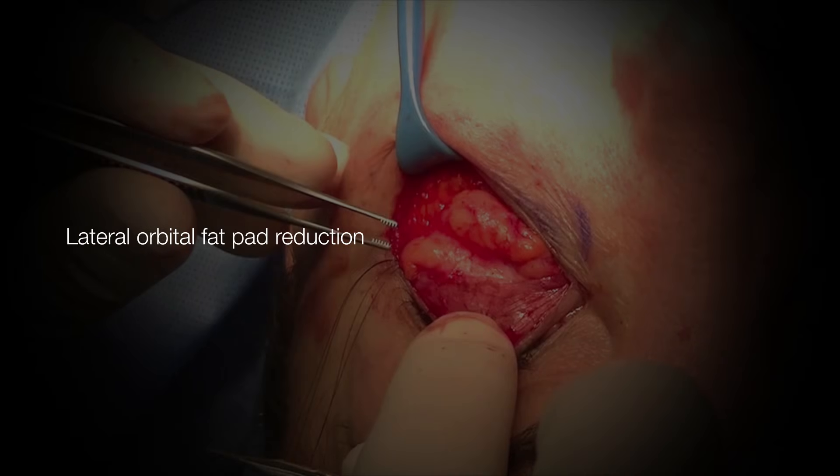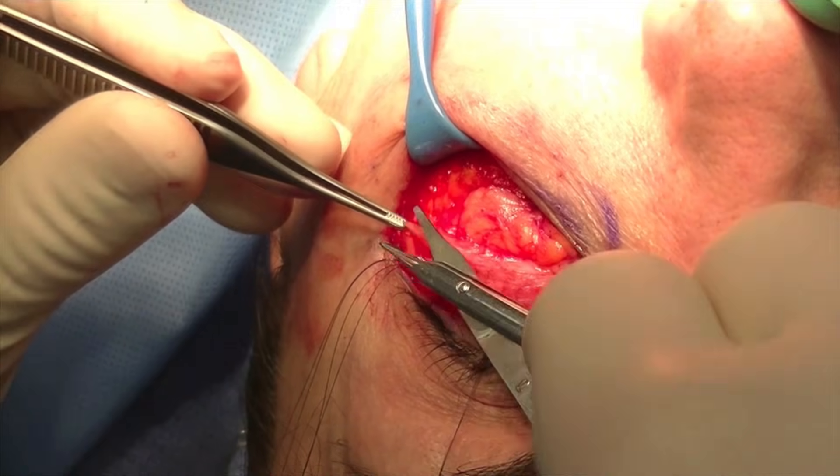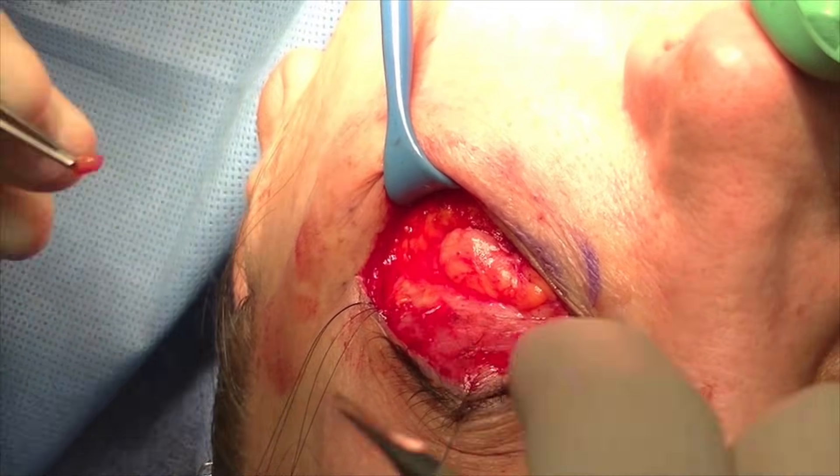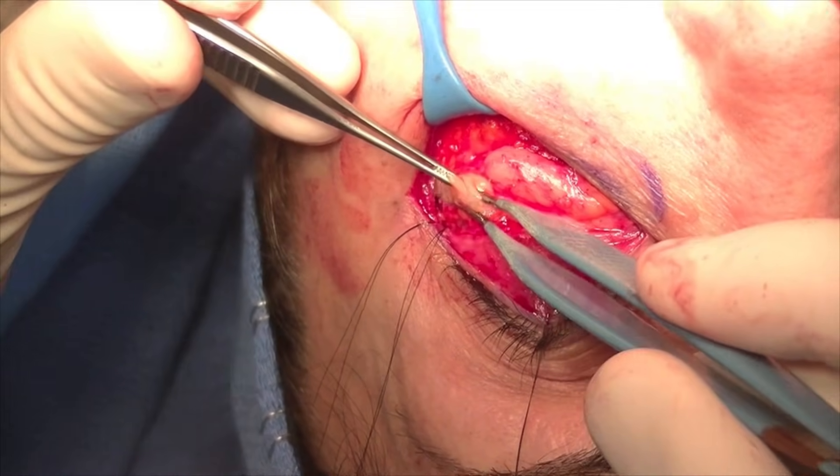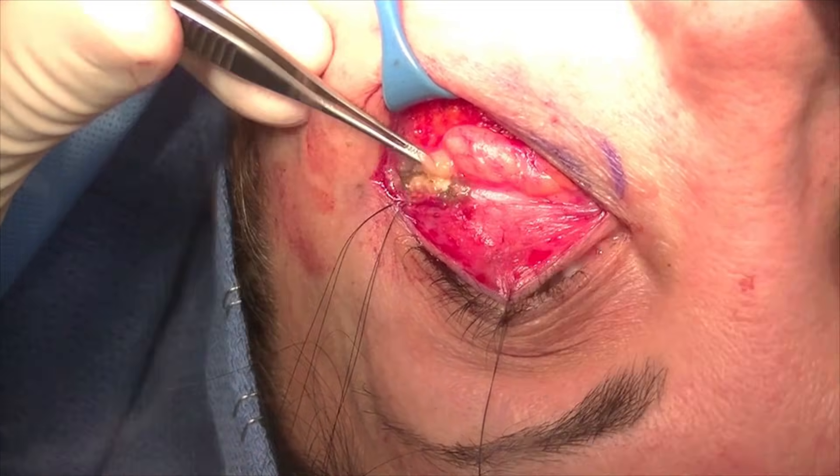Next, I reduce the lateral orbital fat pad. I do this because I found that transposing the lateral orbital fat will often retract and result in fullness in the lateral orbital region. I usually reduce this fat with the bipolar forceps down to the level of the orbital rim.